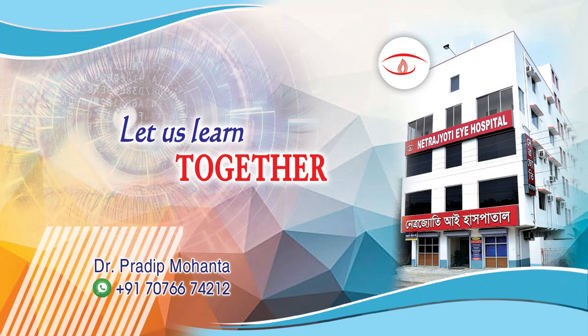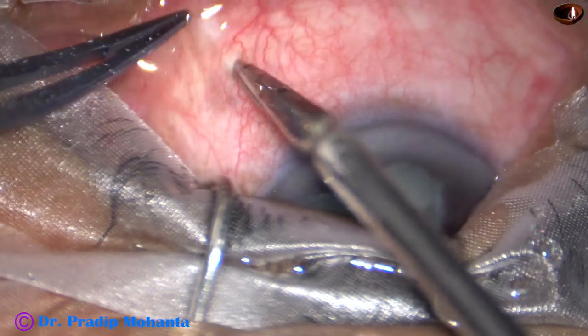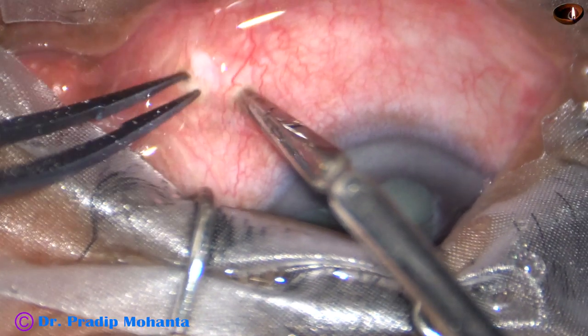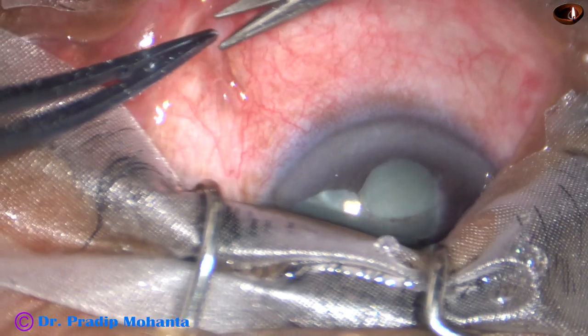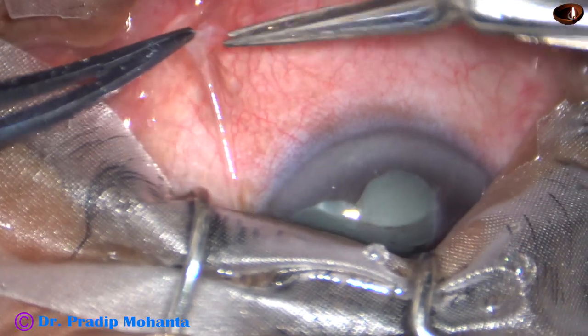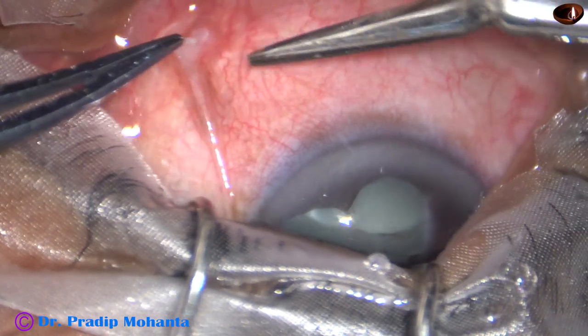Friends, welcome to my workplace at Ranaghat, West Bengal, India. This is a sub-Tenon's block for managing a traumatic cataract. The patient sustained trauma about one month back. The eye is quiet now and I have taken up this case for surgery.